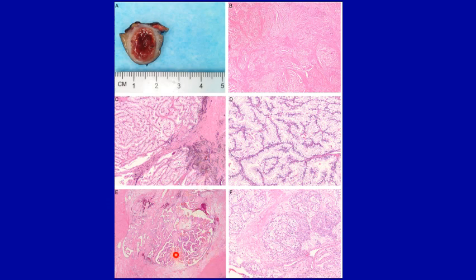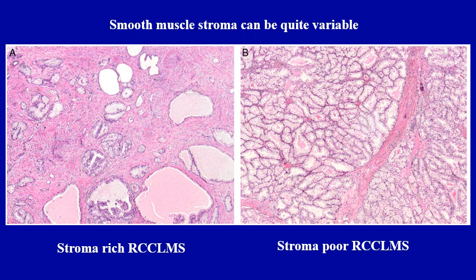These tumors also demonstrated focally prominent papillary morphology in many cases and often had biphasic collapsed acini surrounded by tubules with voluminous clear cytoplasm. Very interestingly, the stroma can be quite variable in this tumor — here is an example of stroma-rich RCC-LMS, while here is an example of stroma-poor RCC-LMS. In our opinion, stroma is not the definitional character of the tumor; rather, it is the epithelial characteristics that are the definitional features.